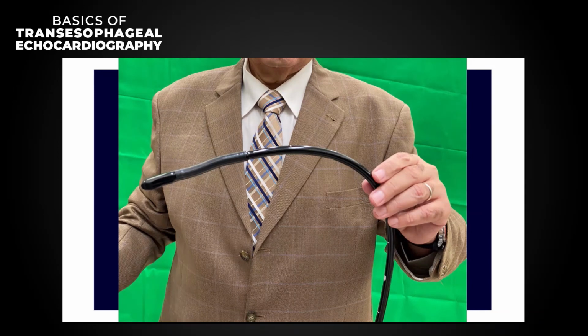Thank you, Rasha. Ali asks, should we perform TEE on all ischemic cerebrovascular patients, regardless of whether sinus or AF, searching for an embolic source? Yes, if you have an unexplained stroke, and this stroke, according to the neurologist, has been considered embolic, not thrombotic, and you cannot find the cause for it, it's better to do a TEE, particularly in young adults.